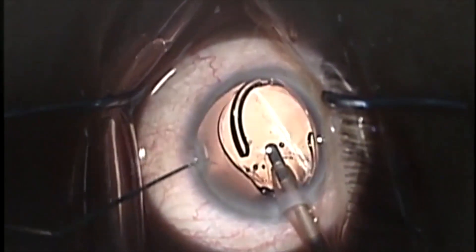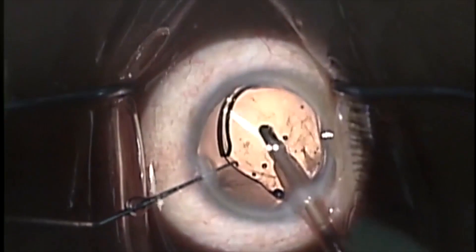What we see so far is that the lens is very rotationally stable, comparable to the Comfort model with four-point fixation — even though this one only has a C-loop. The patients are extremely happy. The optical quality is very good and the lens also centers itself really well, so the near segment works efficiently.